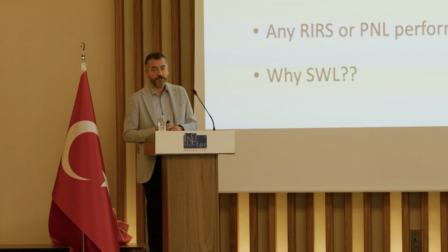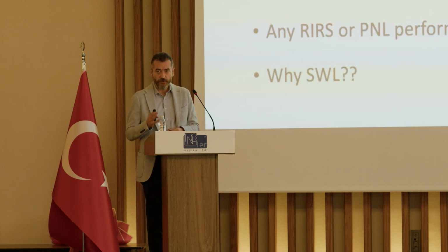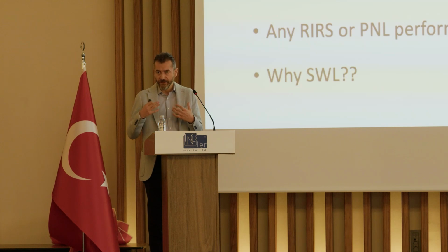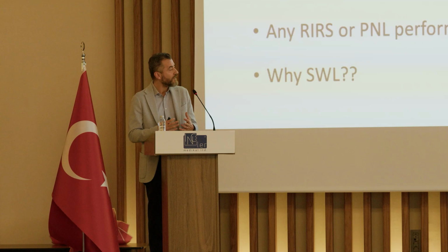And as I mentioned before, we need to have a dedicated team for shockwave lithotripsy. I mean, when you distribute a shockwave lithotripsy device to a hospital, but they do not know what they are going to face, and if they don't have a dedicated team and a good place for shockwave lithotripsy, then the outcomes will definitely not be good.